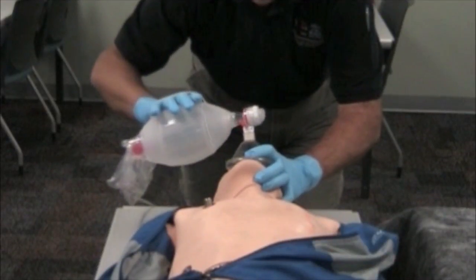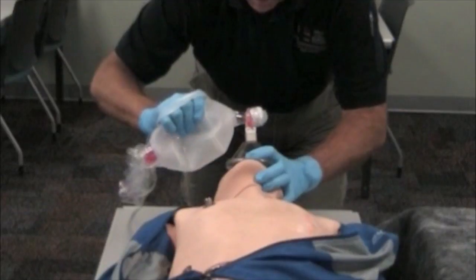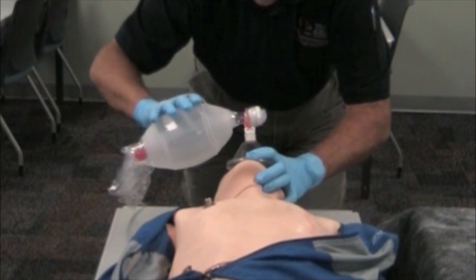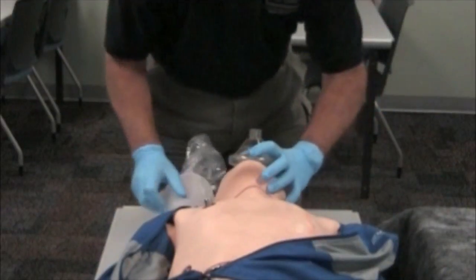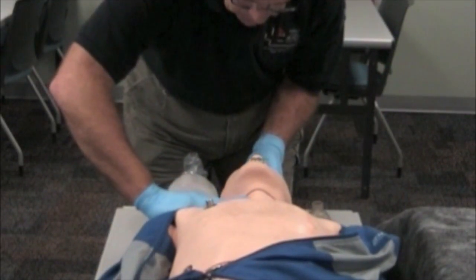Ventilation is being performed without difficulty. It has been about one minute since I began ventilations. I will recheck a pulse. You have a weak carotid pulse at a rate of 60.